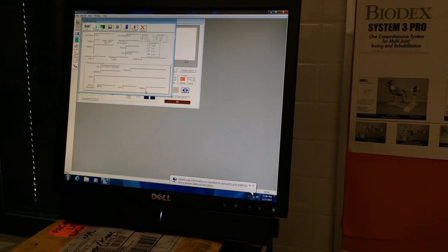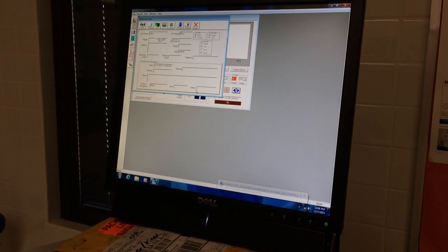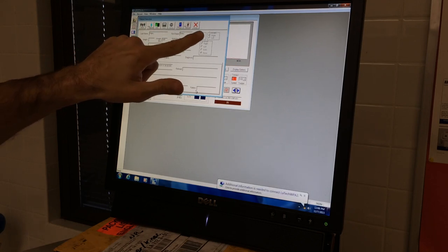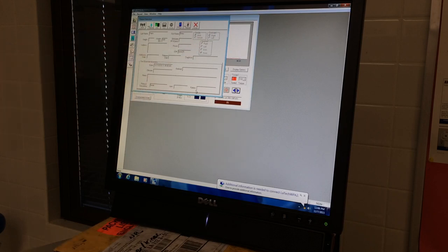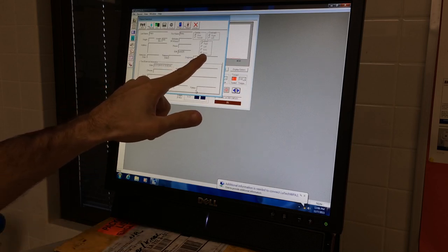So we're going to be testing Bo Haynes today. We put his information in. What's very important that you make sure you get in the computer is the first and last name, so Bo Haynes. His gender, which is he's a male. We're going to be doing his right leg, that's his dominant leg. Involved would be if you were testing somebody coming off of an injury. Involved leg means which one is the injured leg. In this scenario, he's not hurt. We're going to click none.